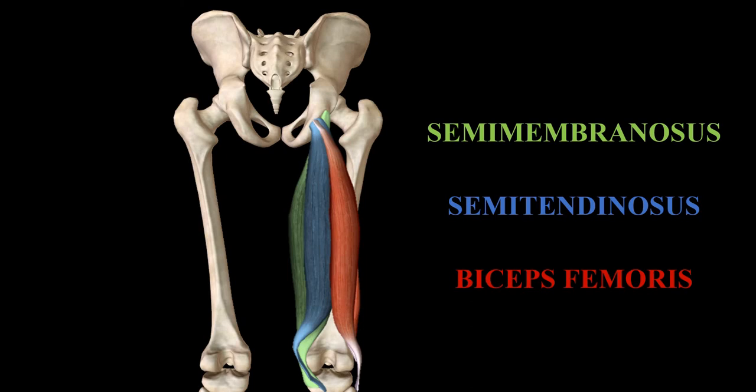Now, this brings us on to another possible issue with EMG analysis, and I'll upload some studies on the Brightspace about this. Now, your hamstring muscles are one of the longest muscle groups and individual muscles in your body.